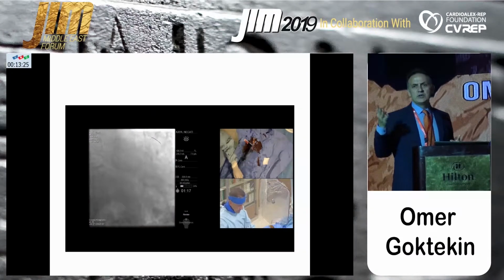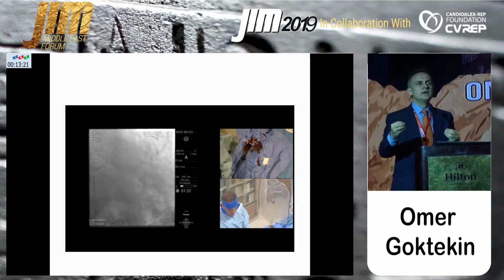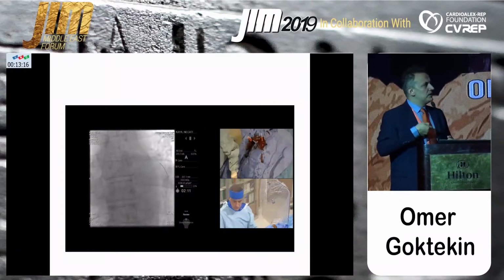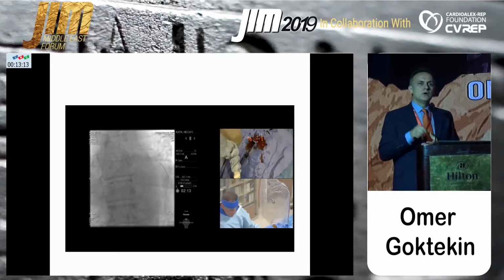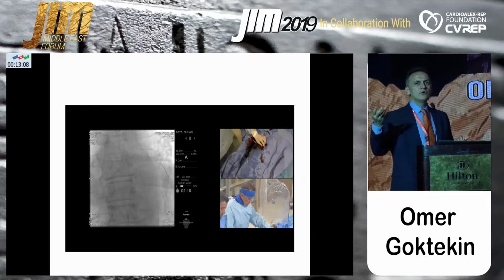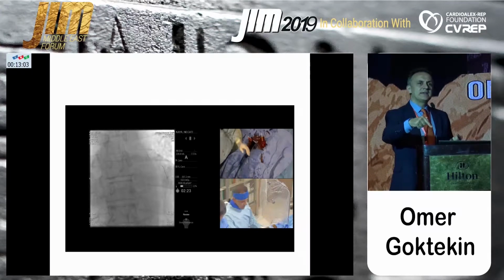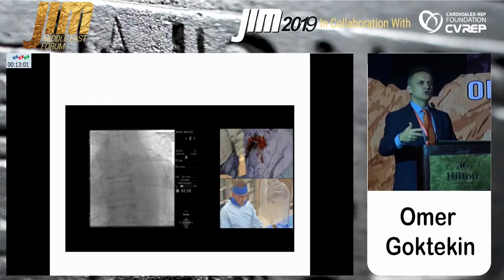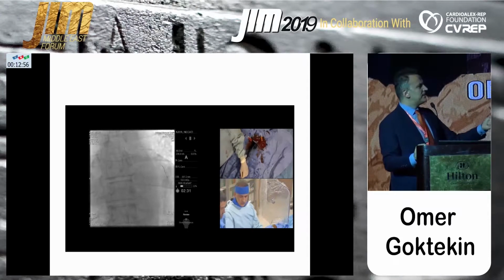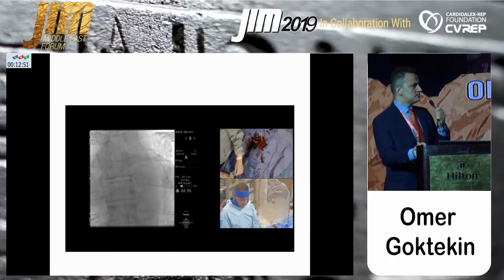To do that, I have three options. The first, extension wire, which is, I think, another cost, or the Nanto technique. We can give some pressure onto the microcatheter, and the microcatheter almost comes out itself. We call it Nanto catheter. And the third is the trapping technique. We trap the wire at the tip of the guiding catheter. Mostly we use trapping these days because we use the trap many times during a CTO case. But in this case, I like to show the Nanto technique, and we do the Nanto technique in this patient.